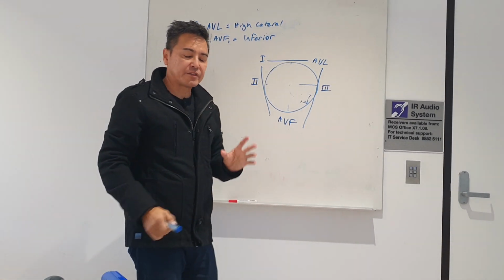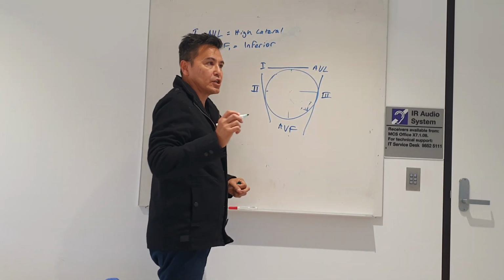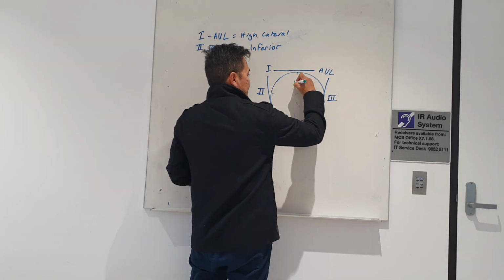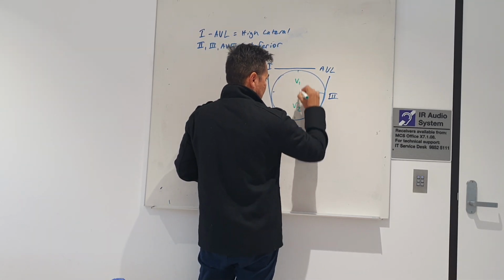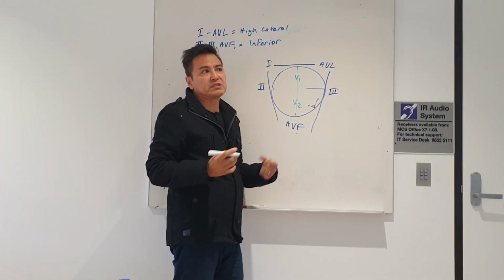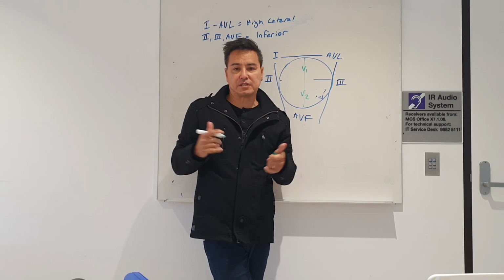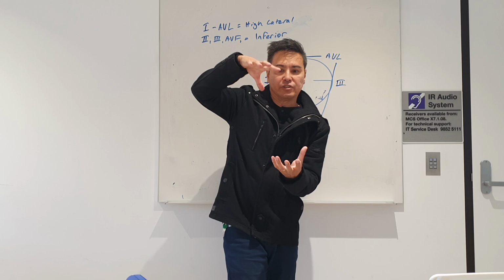Right? Now this is where things start to get interesting, okay? Because you'll notice on the ECGs that they now are actually talking about V leads, all right? So V1, and apologies for the squeaking, and V2, they're our septal leads. So what does our septum do? Our septum is a very important structure of our heart. It keeps oxygenated blood away from deoxygenated blood. But what the septum also does, it kind of plays a bit of a role in our ejection fraction too.